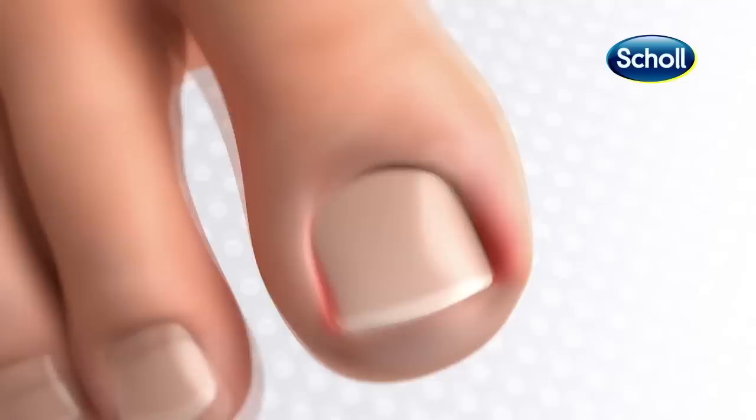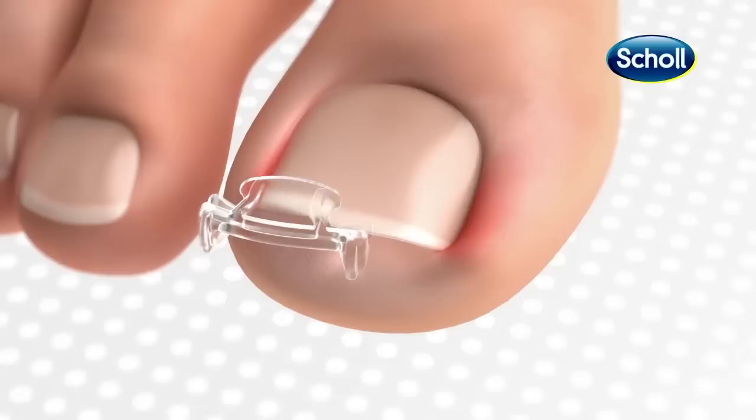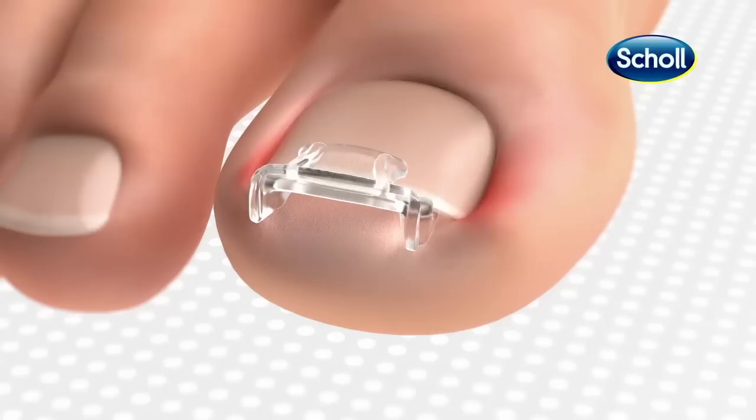Hook one side underneath first, slide the clip across the nail, then hook the other side underneath. Gently press it down and wait for the glue to dry.